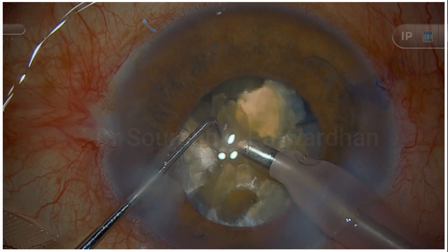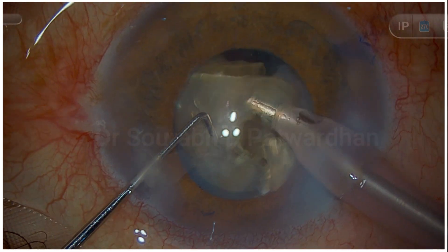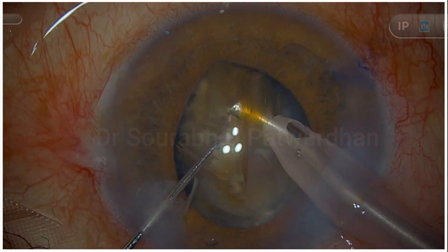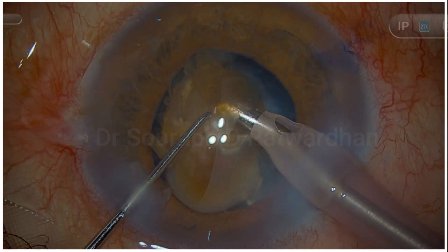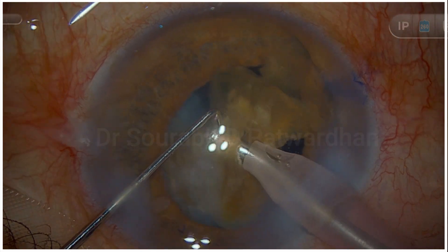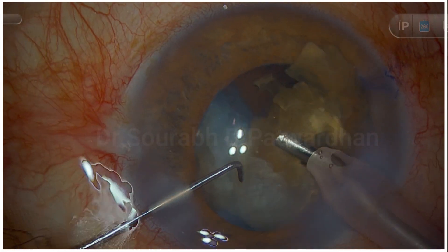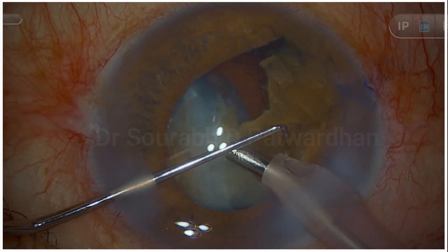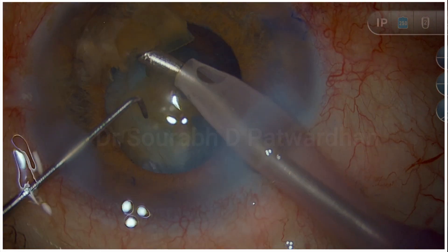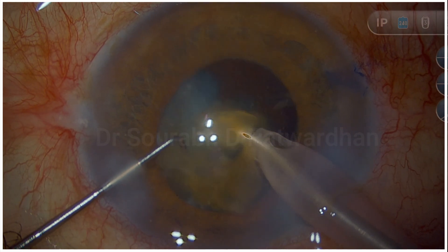With the heavy dispersive OVD, the endothelium is going to be well protected. As I would have coached: just focus on emulsifying these pieces now. Don't try exaggerated attempts at chopping — just complete emulsification of whatever pieces we have made. Make sure emulsification is done at the iris plane level so the effect on the endothelium is least. You can replenish the viscoelastic in between if needed.